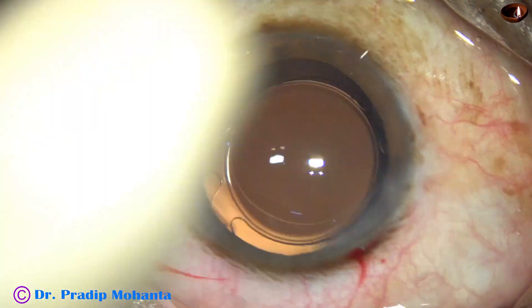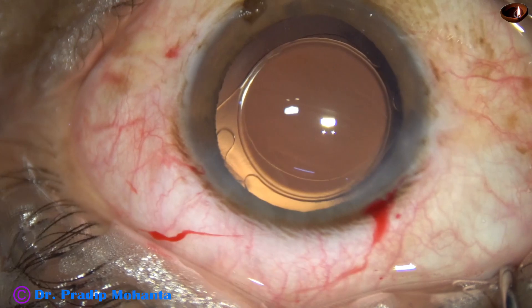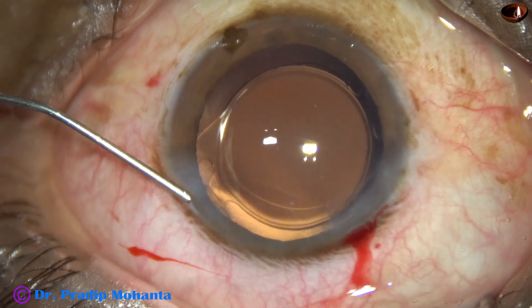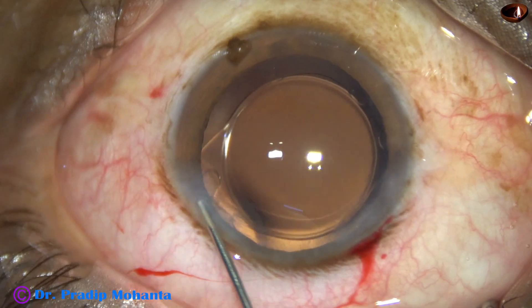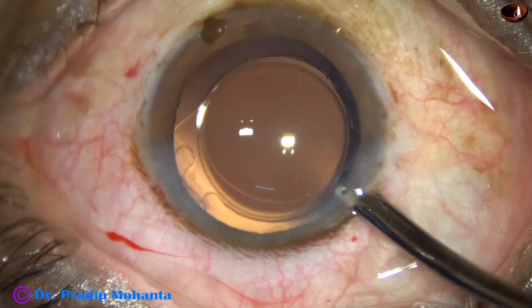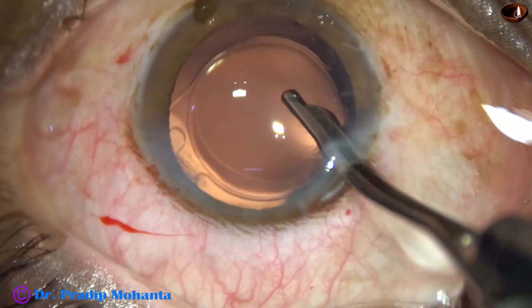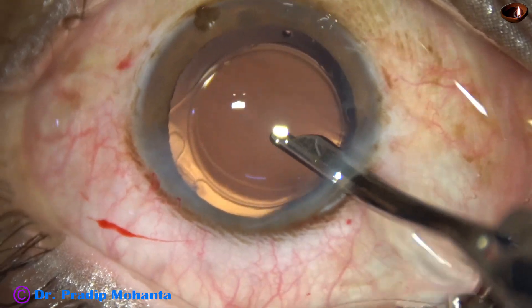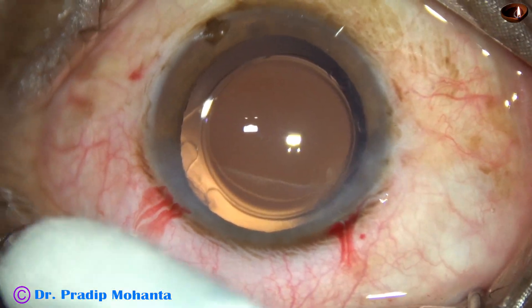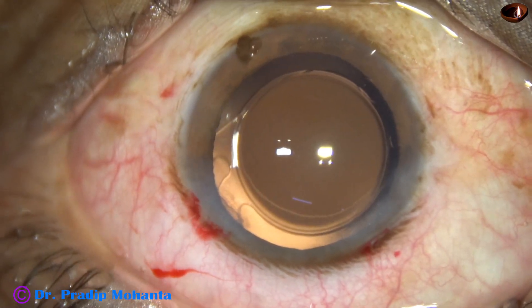We are done. This is a bit of moxifloxacin. The side port is closed by hydrating the corneal stroma. This is the final lavage of the anterior chamber. The anterior chamber is nicely formed, integrity of all the wounds is checked, and a few drops of moxifloxacin are applied over the cornea. The case is concluded.